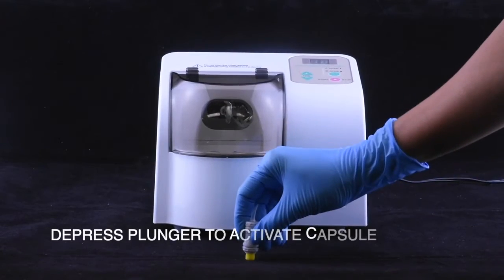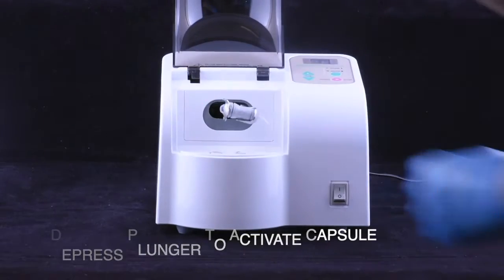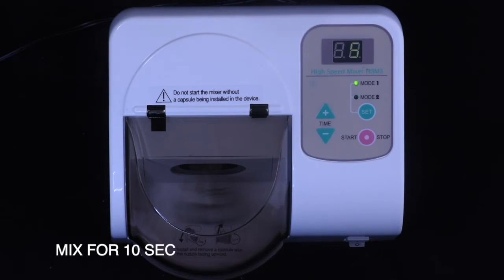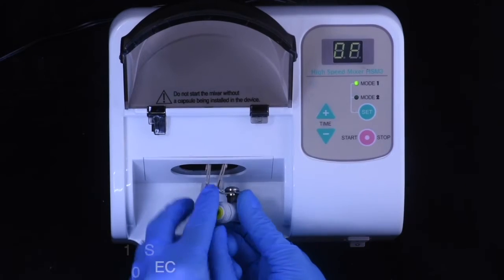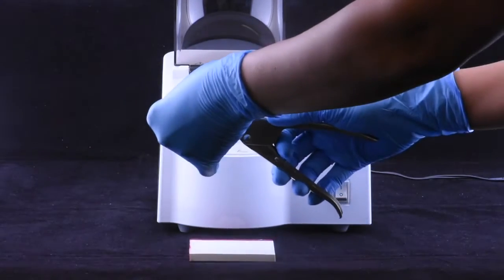Shake the capsule, then depress the plunger to activate it. Mix for 10 seconds. Next, remove the capsule and insert it into the GC Capsule Applier.